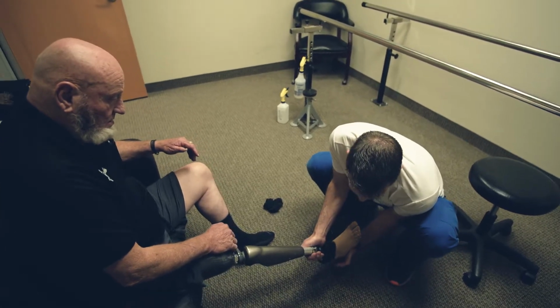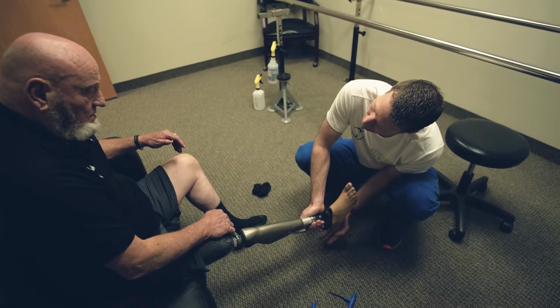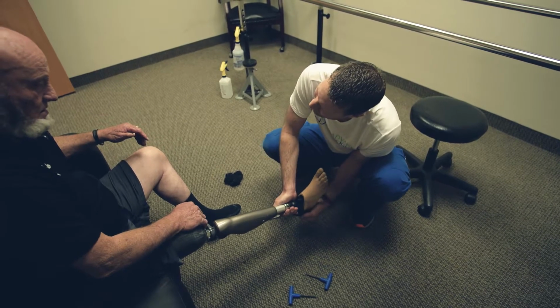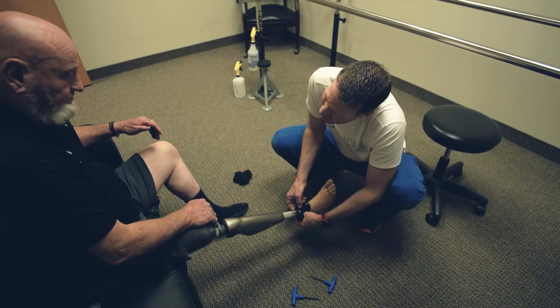We'll see. Not a foot shell, but a shoehorn. Can I push it? You can hear it, listen. Here, clip. All right, so I just pushed until it clipped. My only concern is that with the new one, it's going to be a little harder. It won't be that easy.